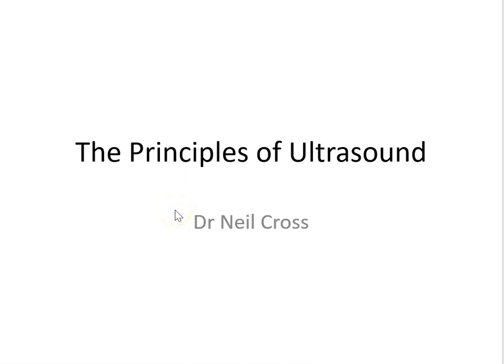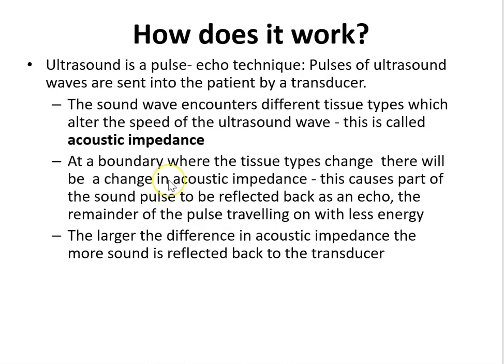Okay, this lecture is for the Topics in Human Biology module, and we're going to cover the principles of ultrasound in human imaging. So in this session I'm going to cover how ultrasound works, and to briefly summarise it, ultrasound is a pulse echo technique where pulses of ultrasound are sent into a patient via a transducer.